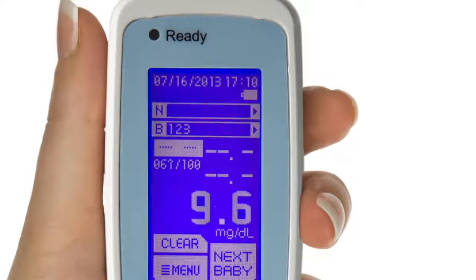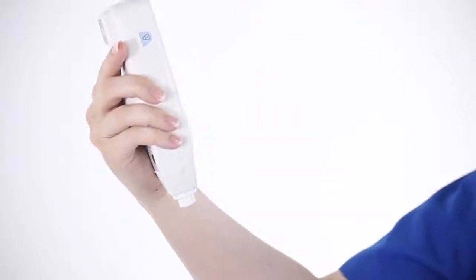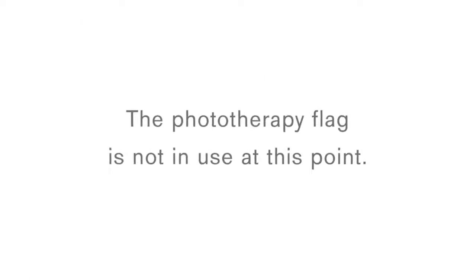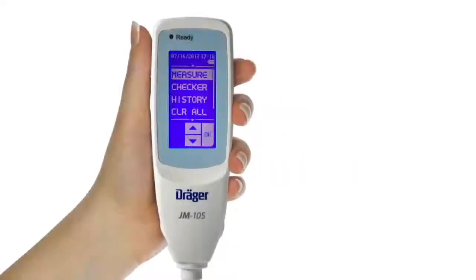Two dotted lines appear on the left side of the screen. Press the first dotted line and the exclamation point symbol appears. The symbol will also appear next to the baby's measurement in the History section of the menu. The second type of flag is a phototherapy flag, which is not used at this time and is intended for future use.